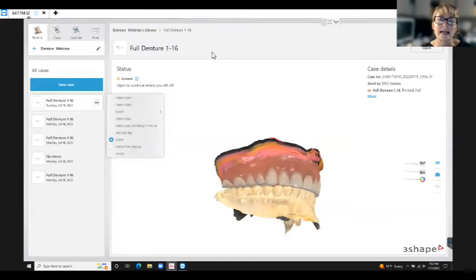If you're struggling at scanning the intraoral cavity, then this wash impression or chairside reline is your next best go-to. We've probably had better success from these wash impressions, which we call a reference denture, versus intraoral scans. You need to be very, very slow and methodical in acquiring the intraoral scan, and that can be quite challenging for some people. I hope that answered your question, Robert.